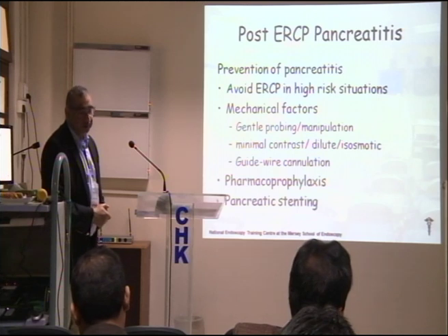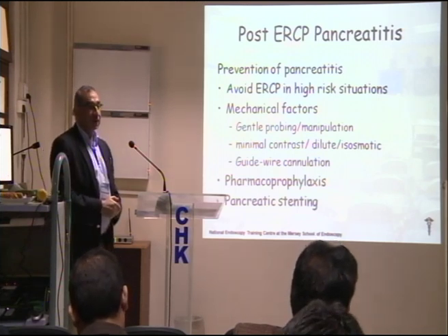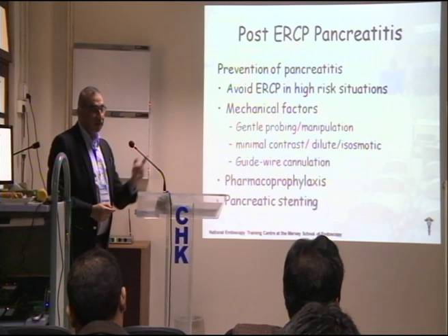I think Khalid wants to speak. Is this technique to cannulate the CBD high risk for acute pancreatitis? We will see. We'll let Khalid speak.